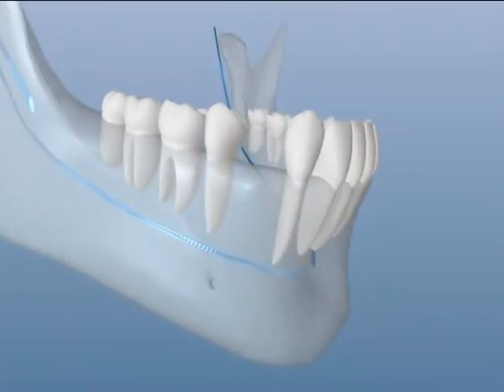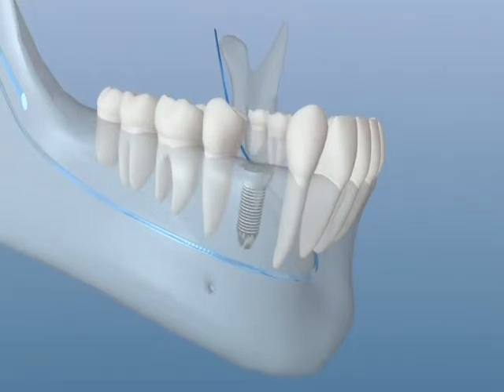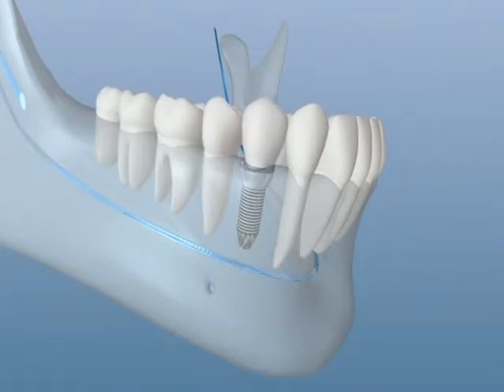In selected cases, the implant may be surgically placed, a cap-like extension attached, and the implant immediately restored with a temporary crown. We call this immediate restoration. In other cases, your surgeon may choose to wait to place the temporary crown to allow the bone to more tightly fuse to the implant. Then, after the usual 4 to 6 month healing time, a permanent restoration may be placed. And during that time, it is important that no chewing stress be placed on the temporary crown.